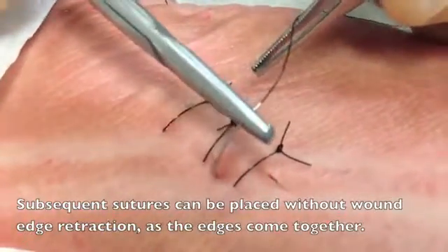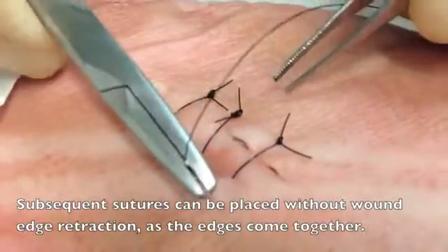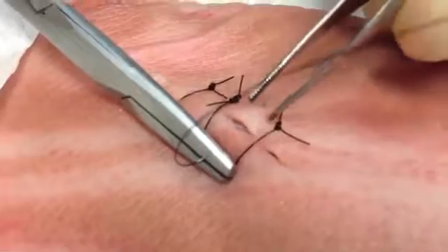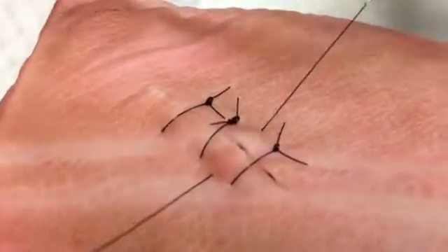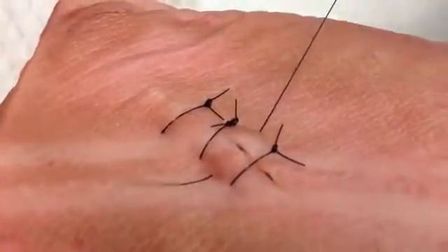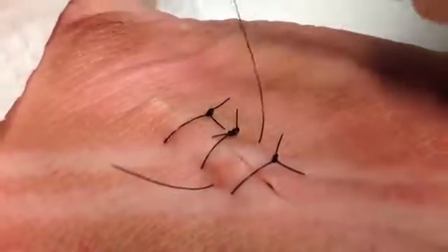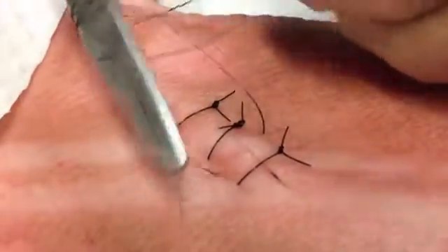You'll get to a point as the wound starts coming together where you no longer need to retract each edge of the wound. You'll actually be able to drive the suture all the way through the wound and be able to tie your knots that way. And it's with these knots that these final sutures are going to start getting the wound edge eversion that you're looking for.